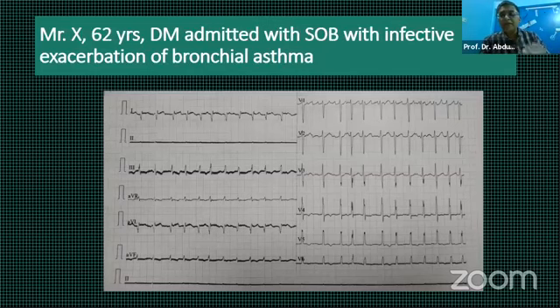I'm very skeptical about the quality of the ECG. It is very likely that hand limb switchover has occurred, hand and arm. That is a possibility. And I will have a look at AVR. It shows positive QRS complex. I'm becoming again more skeptical.